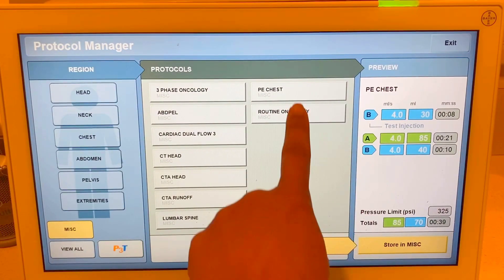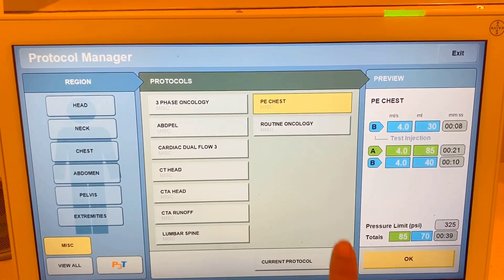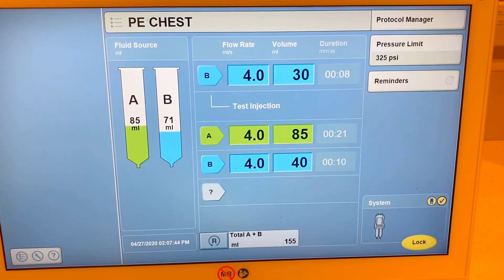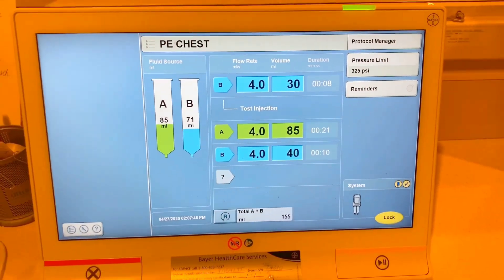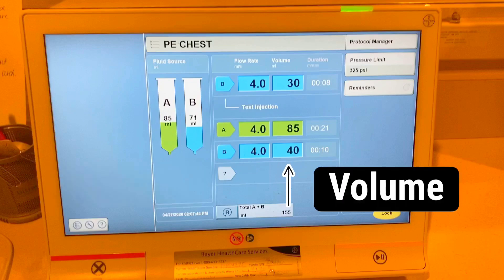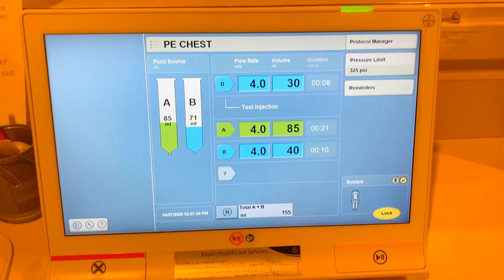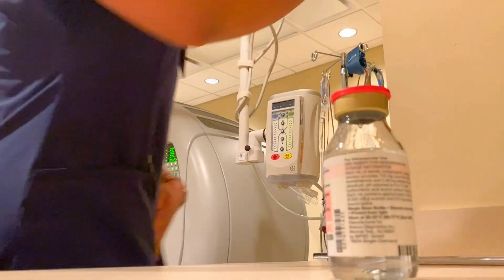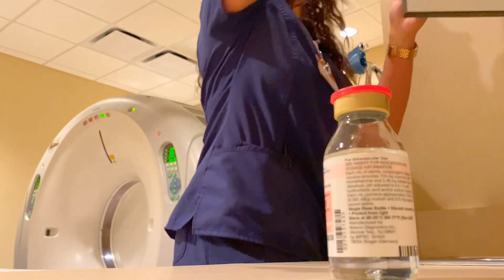Back here on my console is where I set up how much contrast to give and how fast to inject it. On this screen you'll see 4.0 is our flow rate, and this is the volume of contrast and saline the patient will receive.